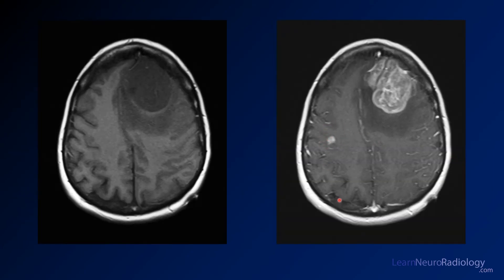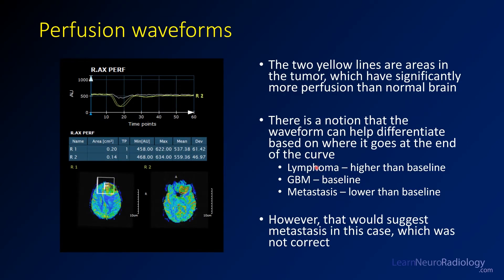Now a little bit about perfusion: there's the notion that you can use dynamic susceptibility perfusion to distinguish metastasis, lymphoma, and glioblastoma by looking at the waveforms for different regions of interest. If the signal doesn't return to baseline, you have a leaky blood-brain barrier and you're more likely dealing with metastasis — ending up lower than baseline suggests metastasis. GBM will return to baseline, and lymphoma will gradually creep above the baseline. You can see that here, but it's just a minor factor and I wouldn't let it change your differential very much.